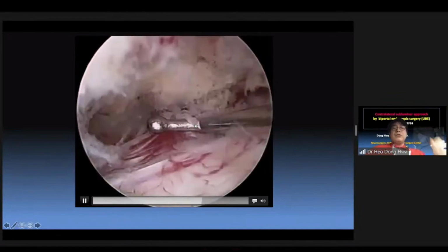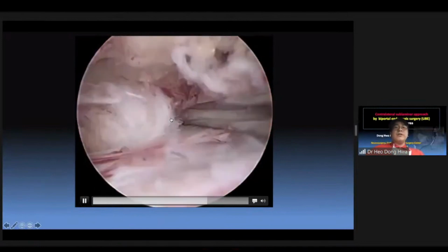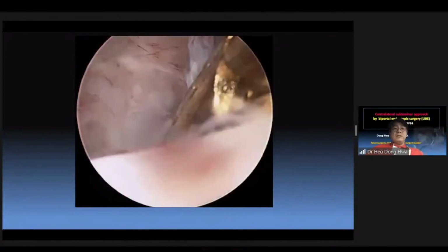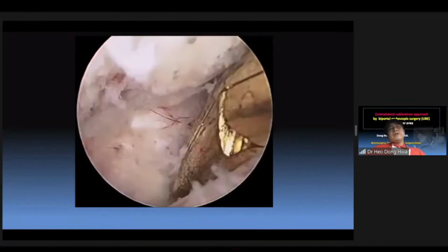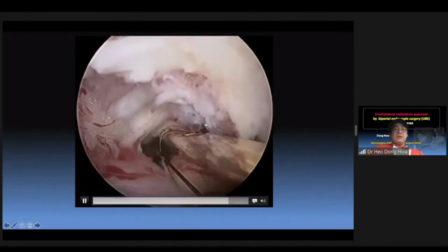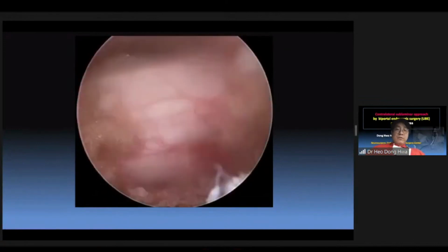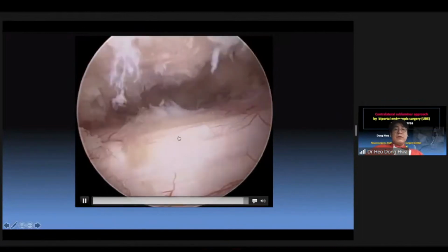And now I move to the contralateral sublaminar approach. I remove all the contralateral disc herniations using the ipsilateral approach. Now I move to the sublaminar area, and complete removal of the contralateral disc herniations here. I also check the axilla portions, and remove the axilla. Now I do annuloplasty using radiofrequency, with ipsilateral decompression and contralateral central canal decompression.